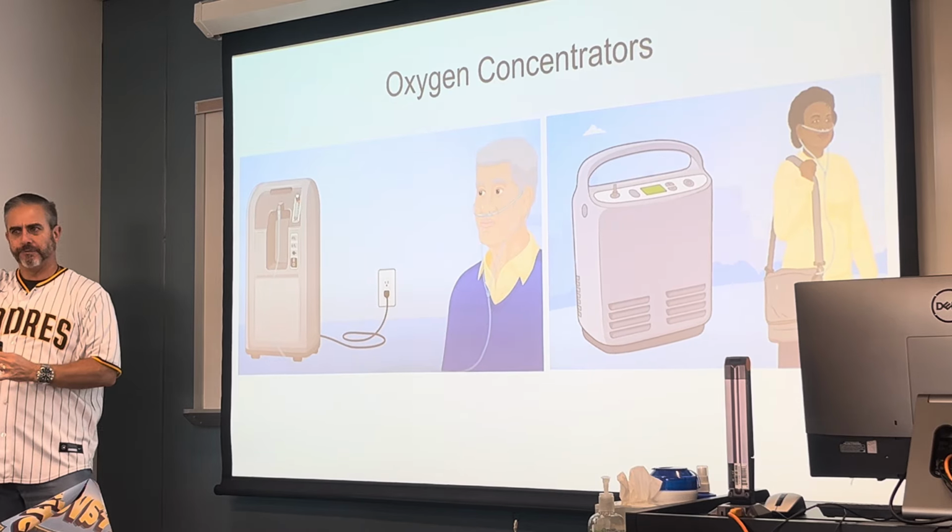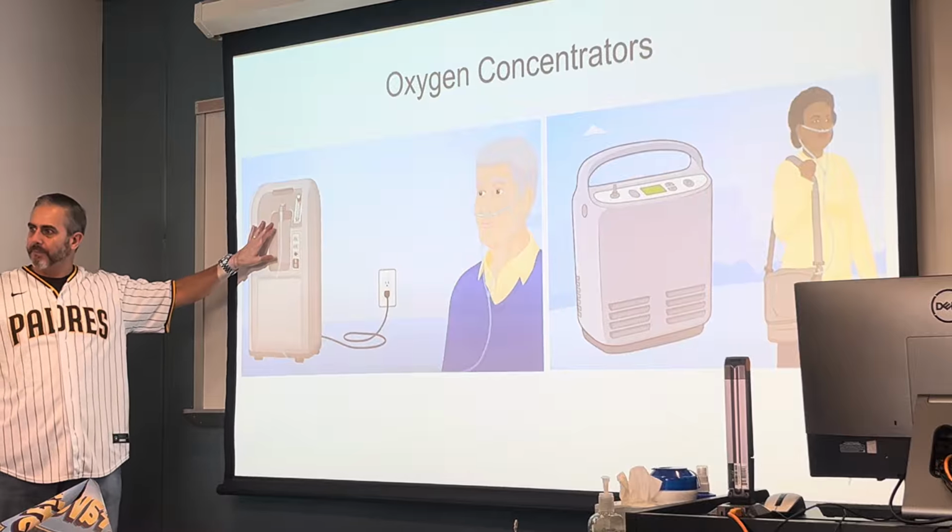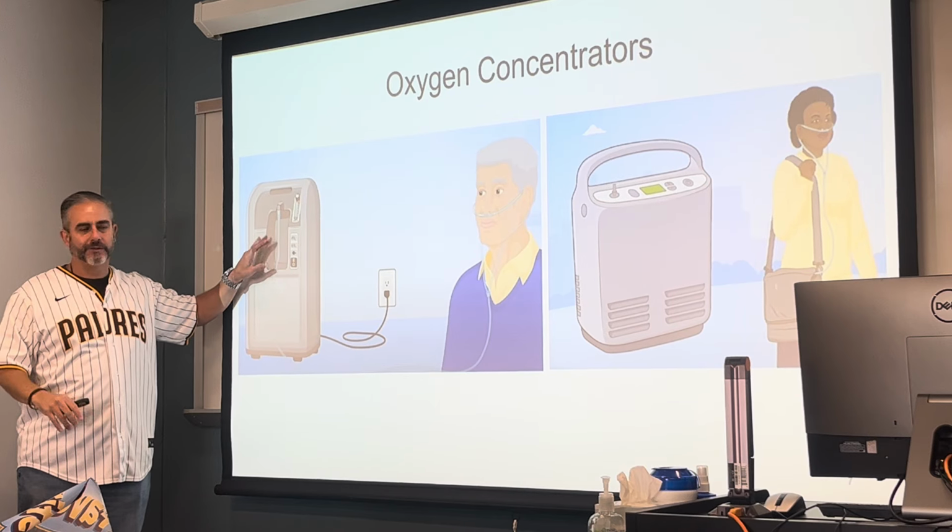which is the exact opposite of how we would think about in a hospital setting. I'll turn the flow meter on higher, they'll get more oxygen. That's true in a hospital setting. This, it could actually work backwards. So you do have to be mindful of that.